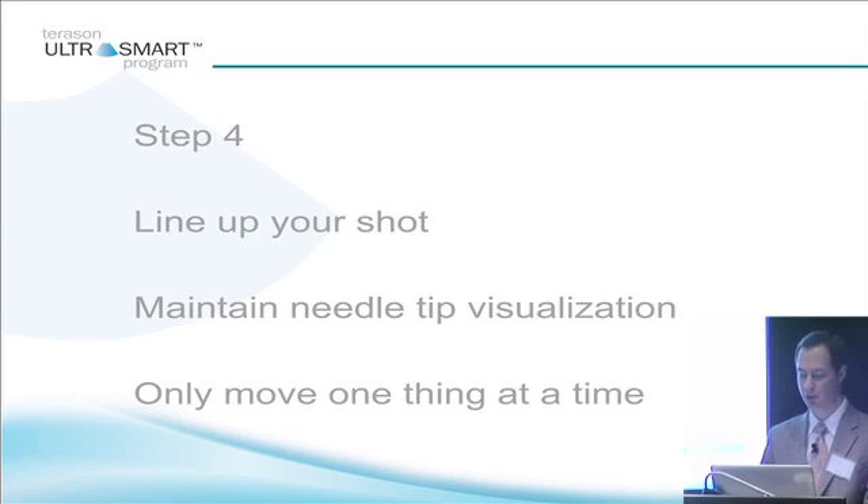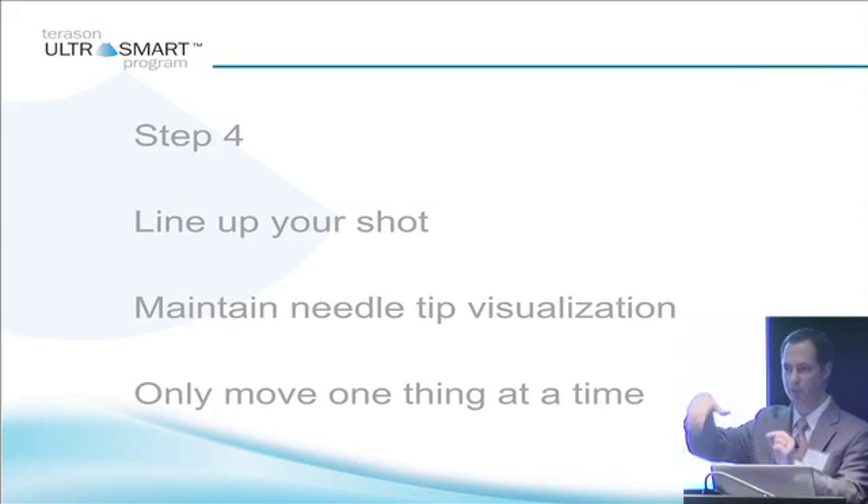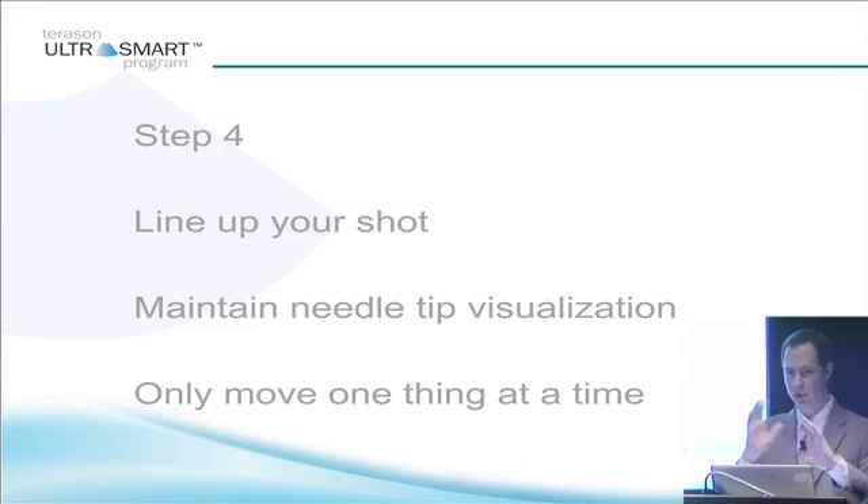As you maintain your needle tip visualization, you only want to move one thing at a time. In the practice area, we're going to either move the needle or the transducer, but not both at the same time. People get into trouble when they're holding the transducer and moving both at the same time. Keep your transducer still, move your needle; move your transducer, move your needle — not both at the same time, one at a time. It allows you to maintain constant visualization of your needle and your structure.